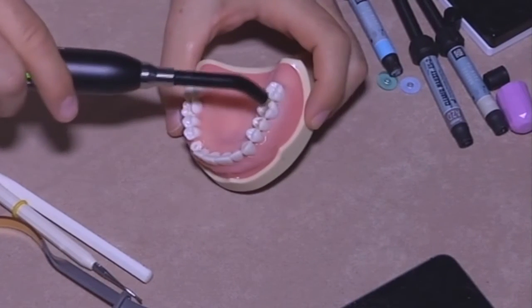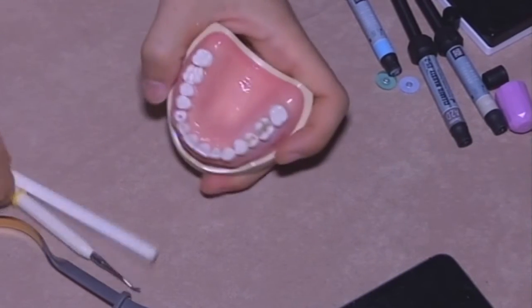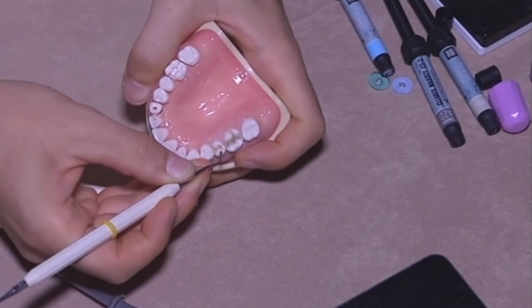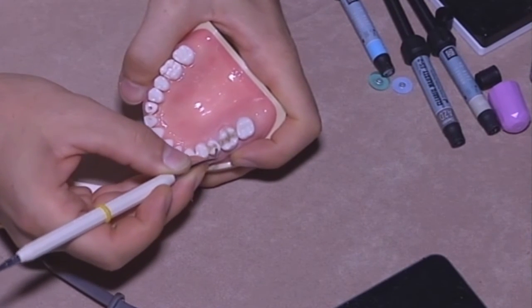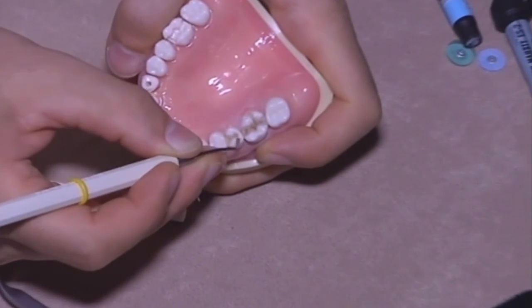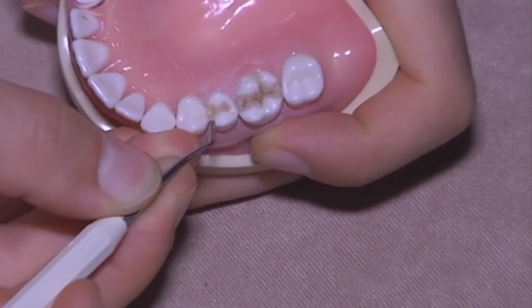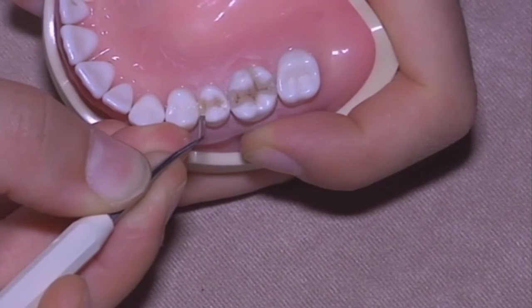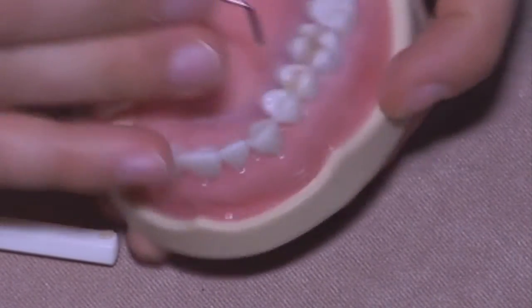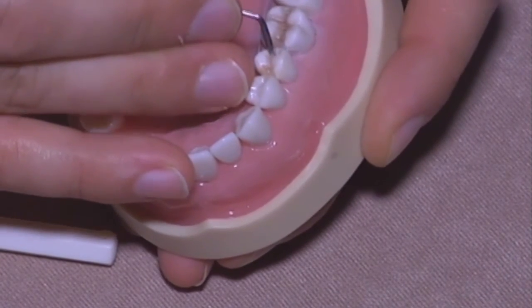I just want to even check before if you don't have any excess. Yeah, here you have one. Before completing and passing on the polishing and glossing procedure, just control that you do not have any extra amount of composite over the occlusal margin.